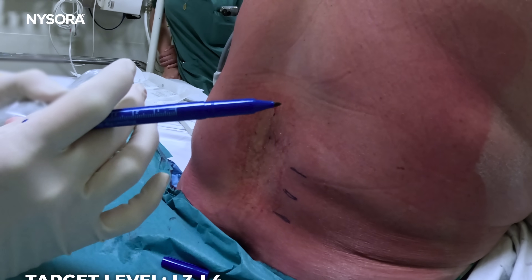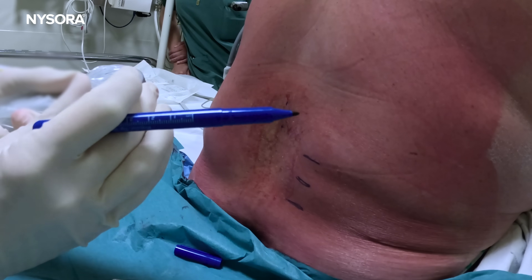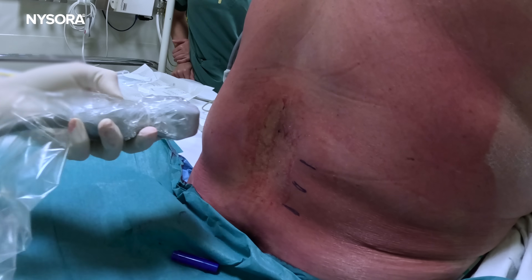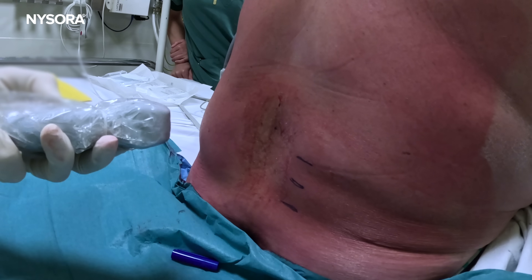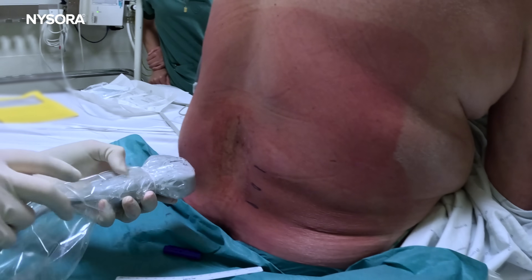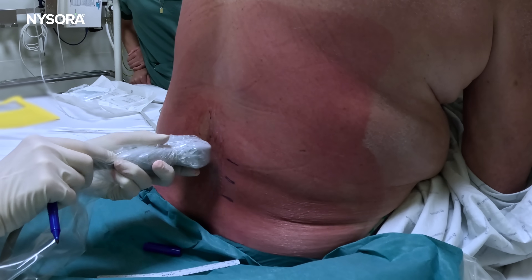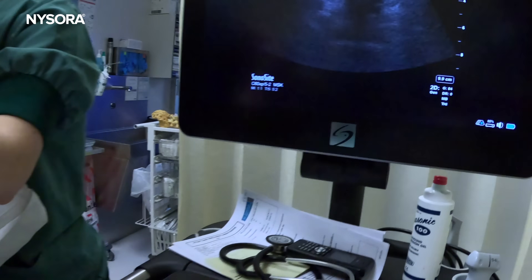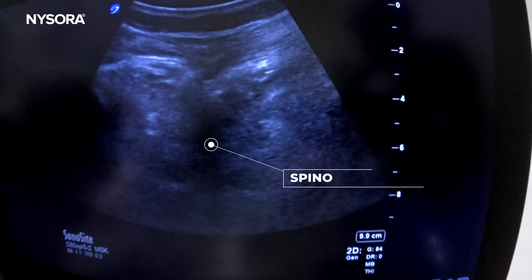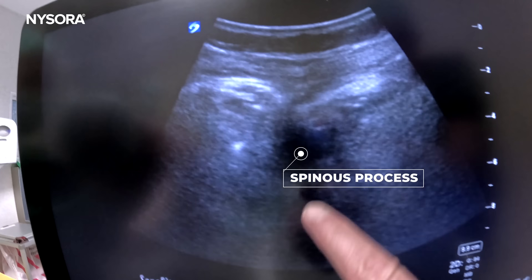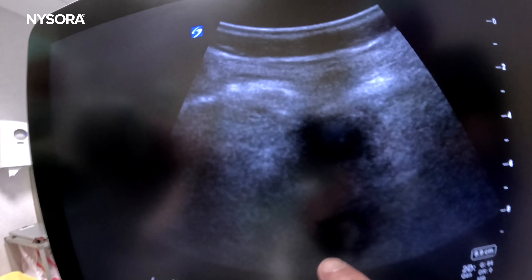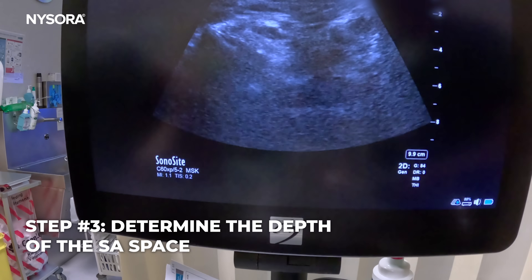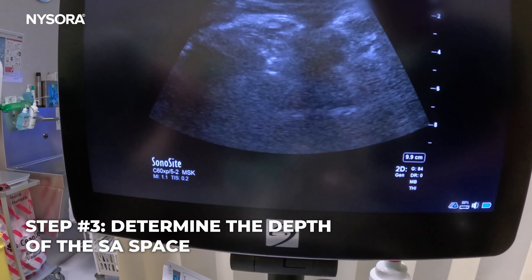In cases where you don't feel anything at all — some patients are quite obese, and with palpation you won't feel anything — you place the transducer and try to see the spinous process; it appears as a black shadow. So the epidural space is at approximately six centimeters depth. Now we know.